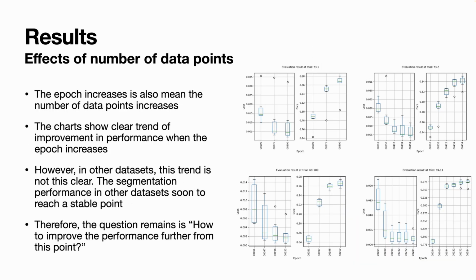Next is the experiment of different numbers of data points. It is meant to see if the number of data points might correlate with the segmentation performance.